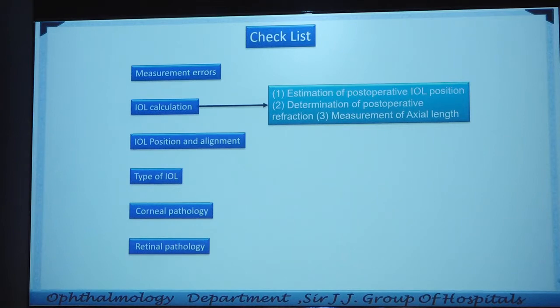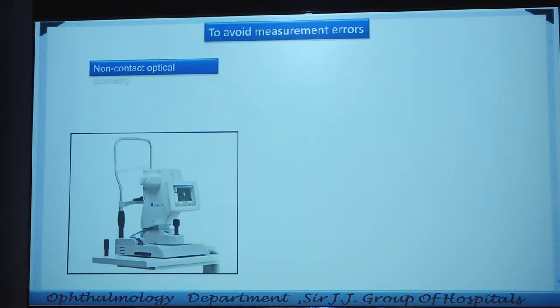Why not? In Marathi, phaco is phekundya. You go for SICS, and when you are going for SICS, the mindset should be proper. Then you must know what your astigmatism is, how much it is at 180 degrees, 90 degrees, 120 degrees, but nothing is seen. And then after that you can measure it properly.